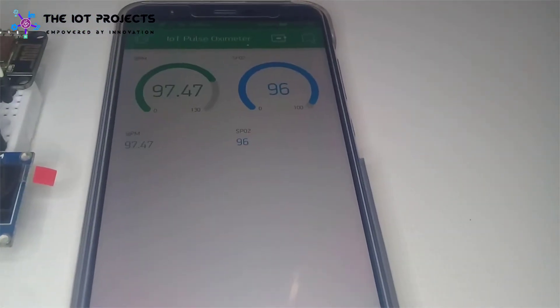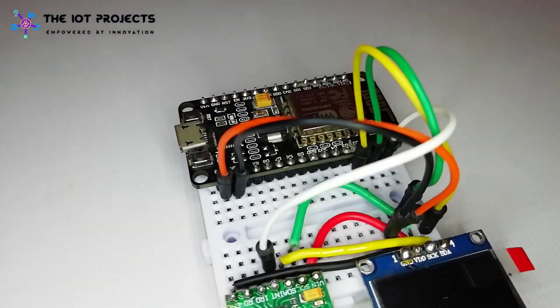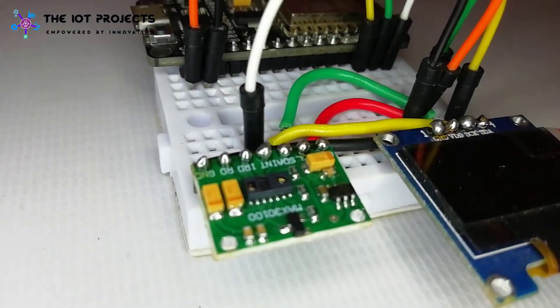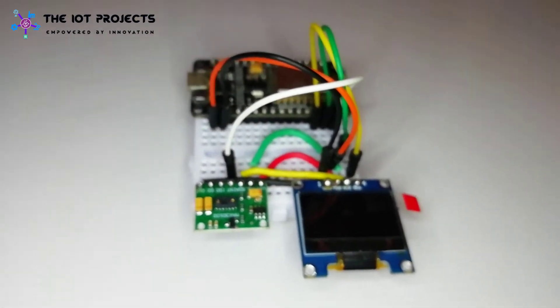To make this IoT-based pulse oximeter, you will need a NodeMCU development board, a 0.96 inch SSD1306 OLED display, a MAX30100 pulse oximeter sensor, jumper cables, and a breadboard.